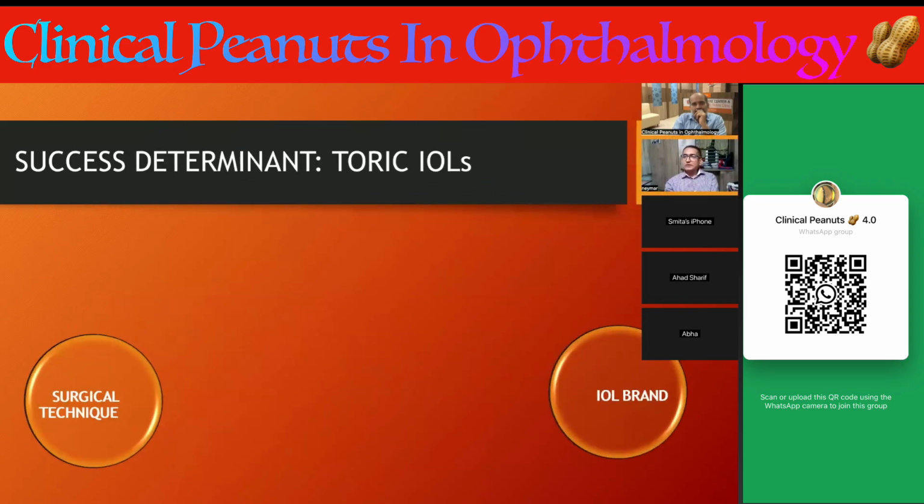So what determines success in toric IOL is, of course, surgical technique, especially in some subsets of cases wherein zonular compromise or zonular weakness is either there or anticipated, like in the case of pseudoexfoliation, and wherever there are chances of progressive miosis, like in the case of IFIS or intraoperative floppy iris syndrome, where progressive miosis will not let you judge the right alignment of the axis after the surgery. These are some subsets of cases where surgical technique of course counts more. Otherwise, the surgery remains the usual cataract surgery.